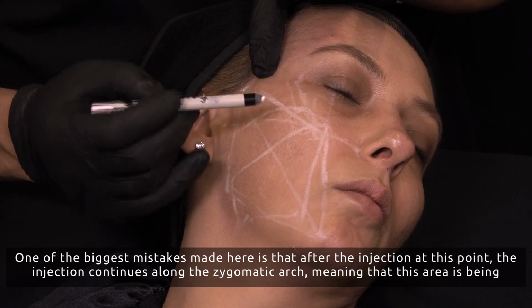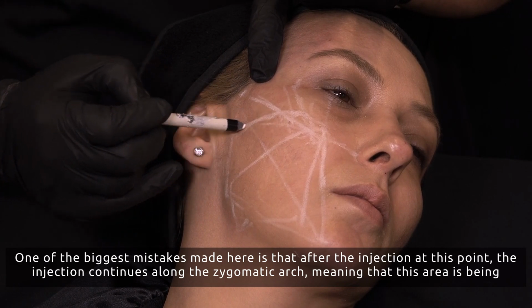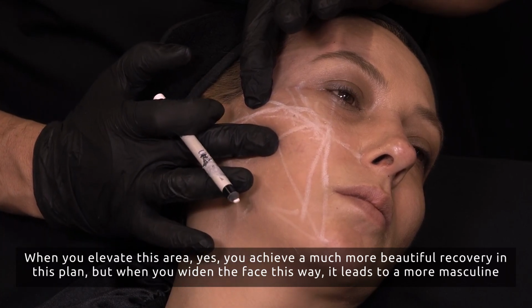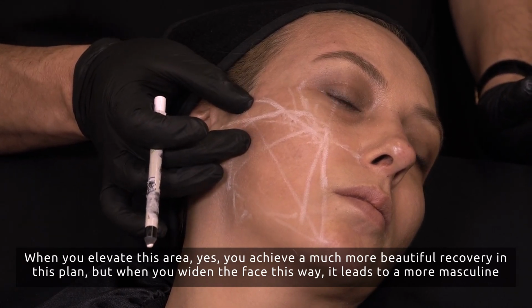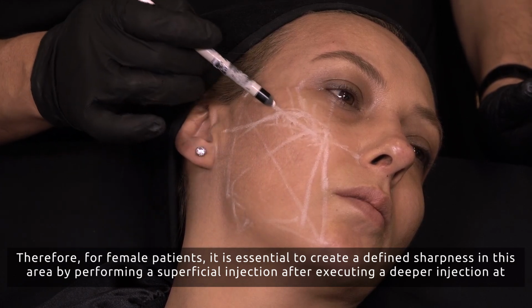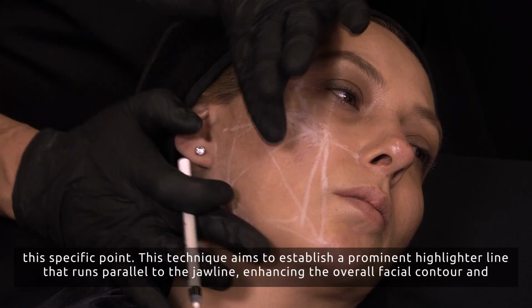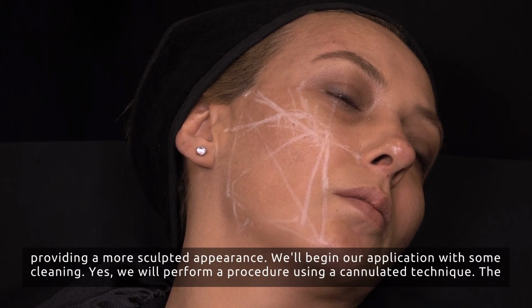One of the biggest mistakes made here is that after the injection at this point, the injection continues along the zygomatic arch, meaning that this area is being elevated. When you elevate this area, yes, you achieve a much more beautiful recovery in this plan, but when you widen the face this way, it leads to a more masculine appearance. Therefore, for female patients, it is essential to create a defined sharpness in this area by performing a superficial injection after executing a deeper injection at this specific point. This technique aims to establish a prominent highlighter line that runs parallel to the jawline, enhancing the overall facial contour and providing a more sculpted appearance.